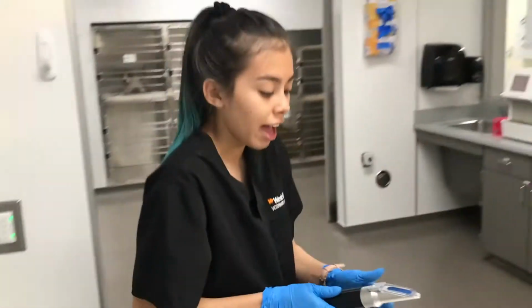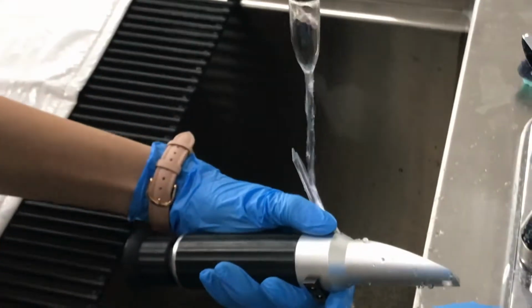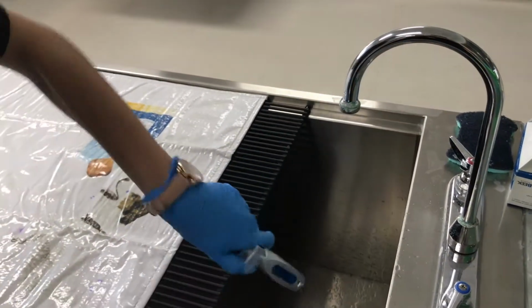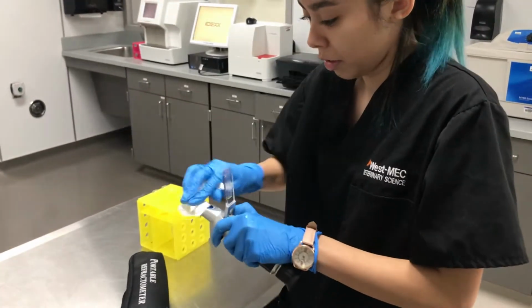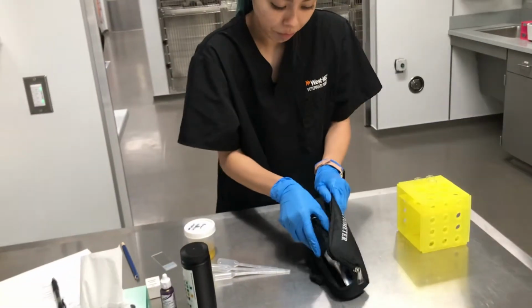And when I'm done with that, I will go over to the sink and wash this off the refractometer. And using Kim wipes, I will clean this off. And I'll put this back into its case.